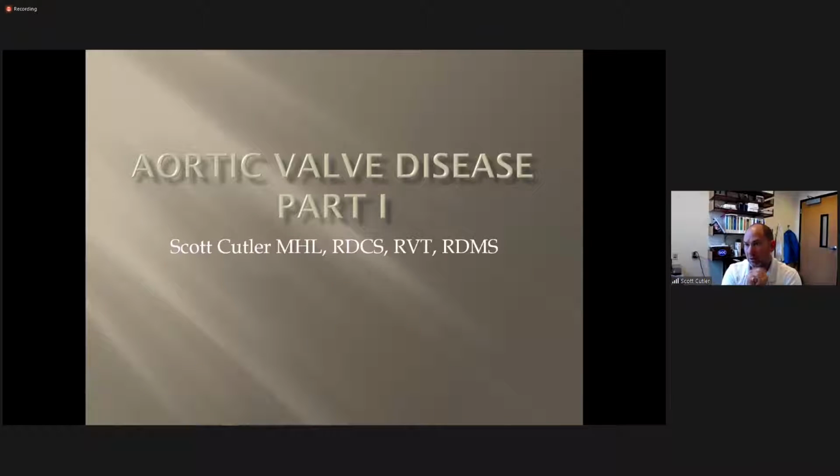So if we thought there was something wrong with the aortic valve, which pictures would you show me that relate to the aortic valve from what you know so far in lab? Just give me some examples. Zoom aortic complex, high ascending, check that, and then the short axis at the base. Okay. So we're showing things that relate to the valve directly, right? Yeah. So why do we zoom in on parasternal short axis, for example?